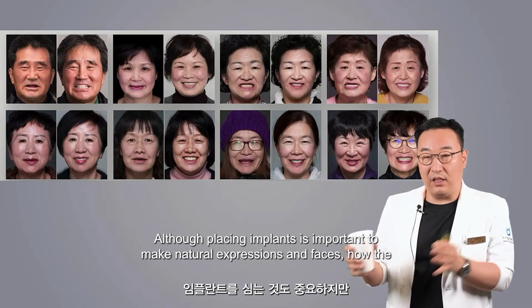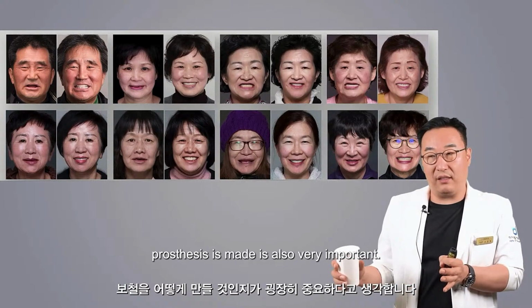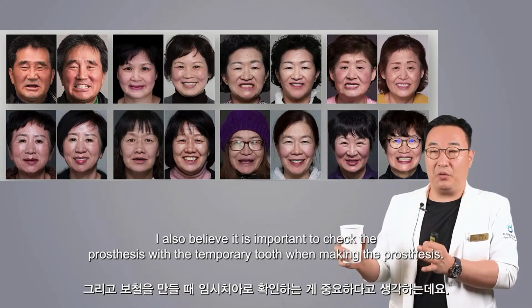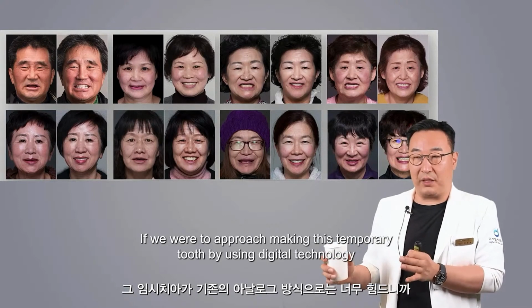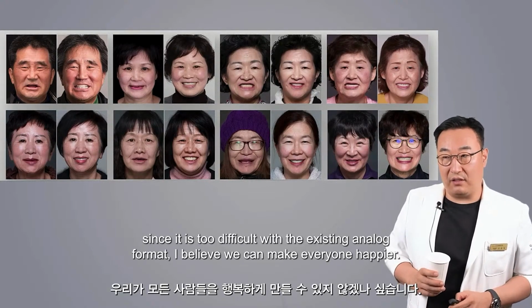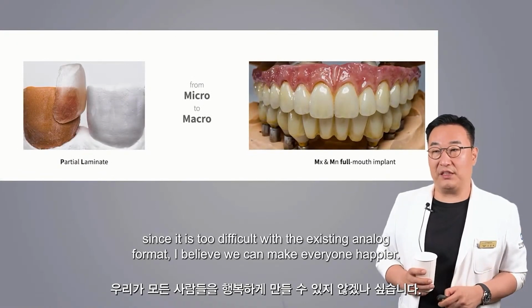Although placing implants is important to make natural expressions and faces, how the prosthesis is made is also very important. I also believe it is important to check the prosthesis with the temporary tooth when making the prosthesis. If we were to approach making this temporary tooth by using digital technology, since it is too difficult with the existing analog format, I believe we can make everyone happier.